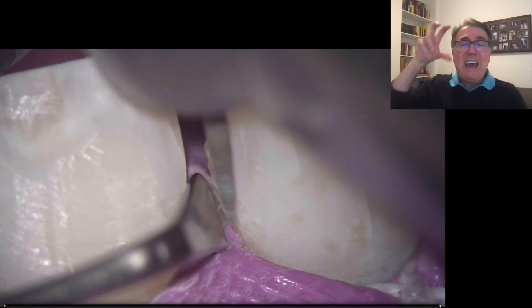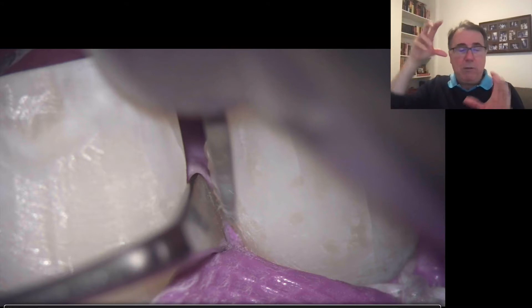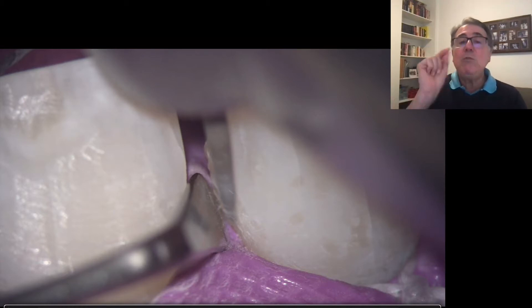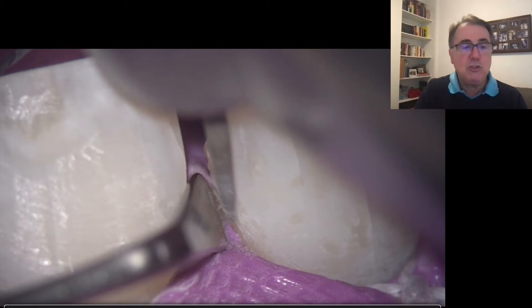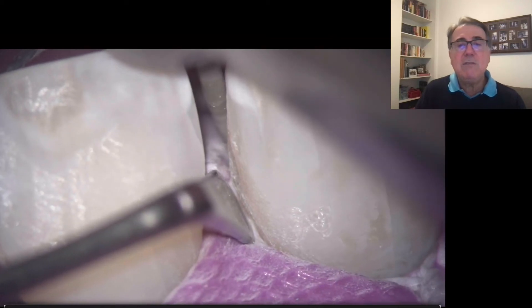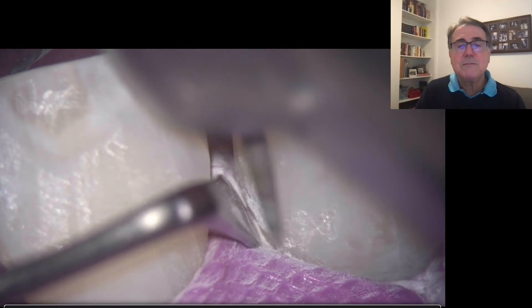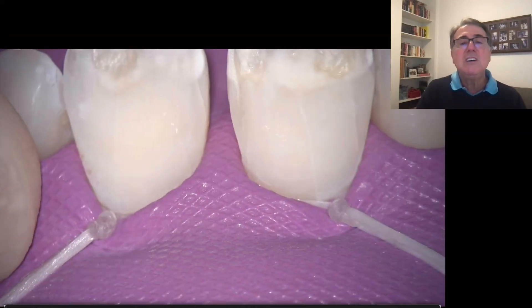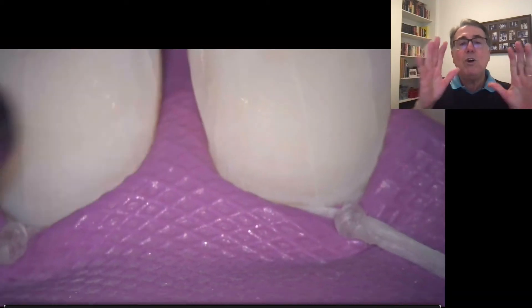What you see here is not a camera recording outside of the mouth — this is a camera attached to the microscope that I'm working with. Everyone who knows me knows that everything I do, I do looking through the microscope, and I have been doing that for the past 23 years. So what you see here is exactly what I see while I'm working. I'm removing all the composites, everything. And then I will condition again — acid etch all over again. Now it's okay, now I can go on with my restoration.